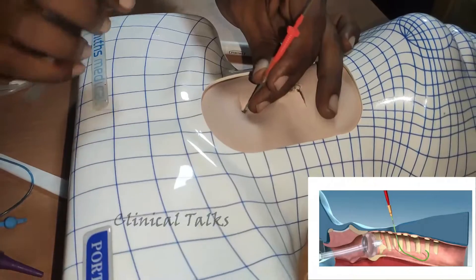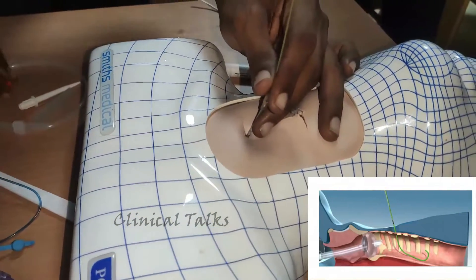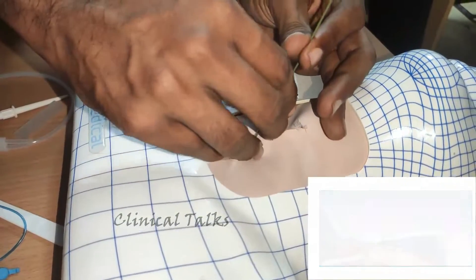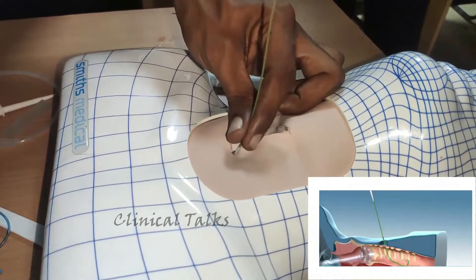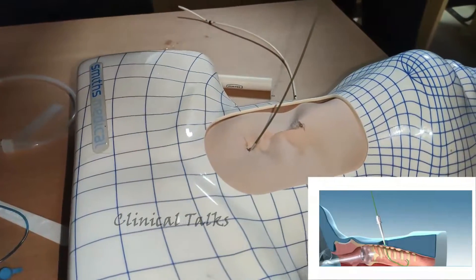As the guide wire will be used to guide components into the trachea, it is important to frequently check the free movement of the guide wire in and out of the components and trachea. Remove the guide wire introducer followed by the cannula. This leaves the flexible guide wire positioned in the trachea.